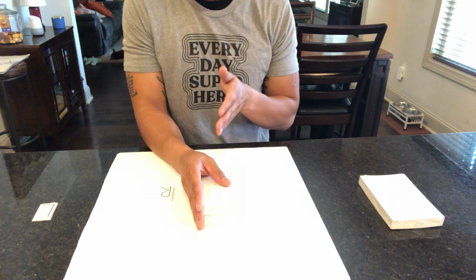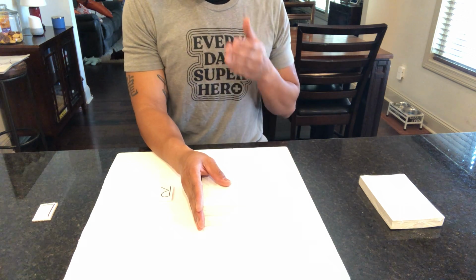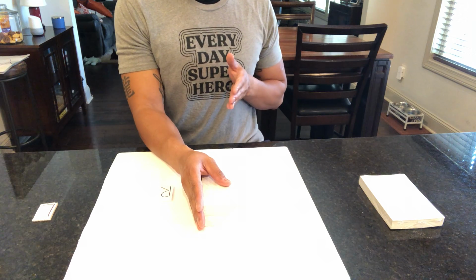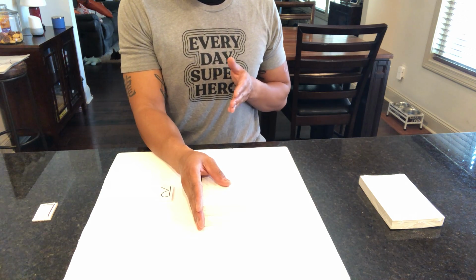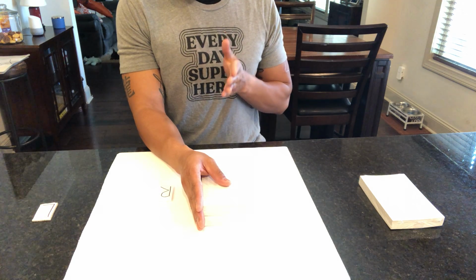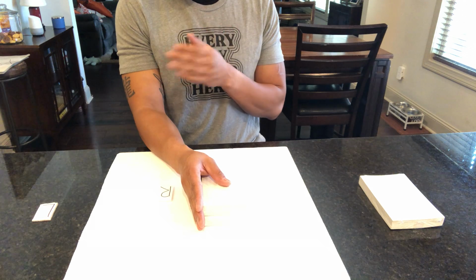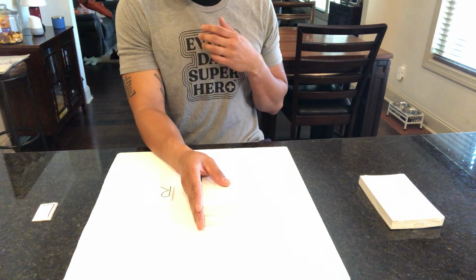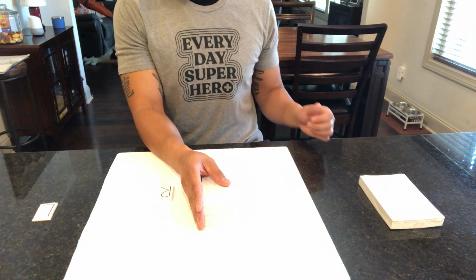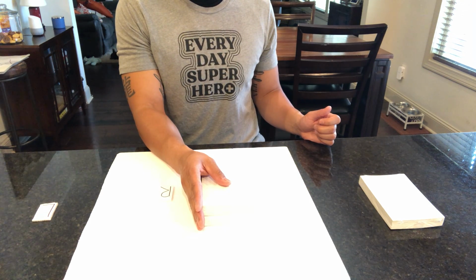Here, the central ray is going to be perpendicular to the first MCP joint. And the line is through the phalange, which is parallel to the film plane. And again, the PA projection of the distal and proximal phalange, first MCP joint, and the articulations. So that's your PA thumb.